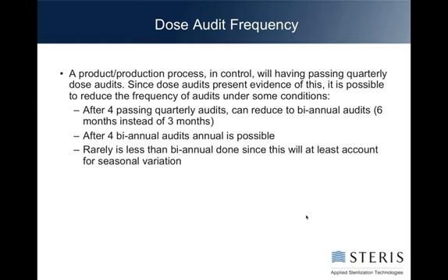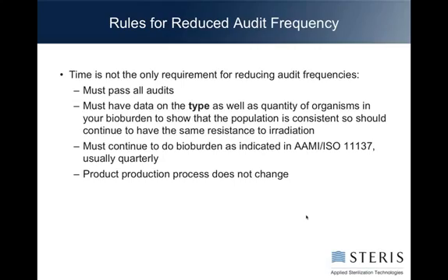Rarely, after you go to biannual, you also have the possibility to go to annual audits. I personally don't know anybody who does annual audits, because even biannual at least gives you data to account for seasonal changes, whereas an annual audit is an awfully long time to go by and not find out that you've had a change in your production process.